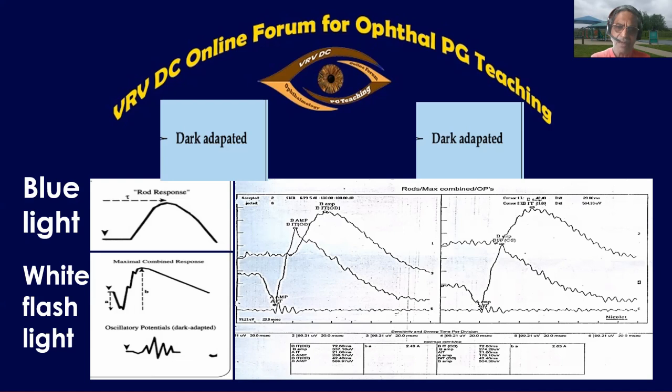They may ask you here. Now I'll tell you, these are all the waves. And the third wave, this is the dark adapted eye. I already told you. You can see this third area here. These are all the oscillatory potentials, generated from the oscillation on the B wave and depicted here. What's the importance here? The oscillatory potentials are normally seen.